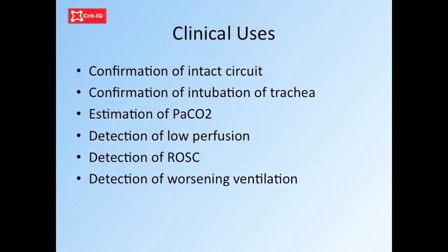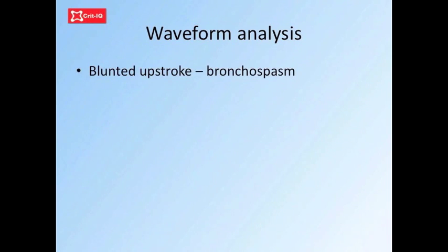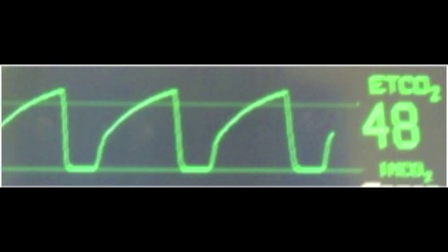A slowly increasing end-tidal CO2 can indicate that ventilation has become impaired and can spark a search for the offending cause. The shape of the capnograph waveform can also provide information. As mentioned previously, there should be rapid clearing of the physiological dead space, resulting in a steep uprise and clearly defined shoulder, leading to a plateau. In cases where small airway flow is restricted, attainment of the plateau can be delayed or even absent.